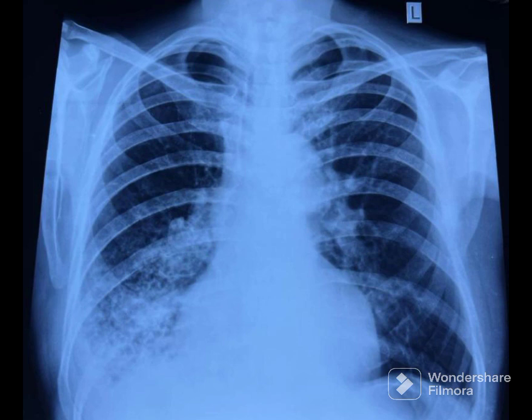Also, the right heart border is partially silhouetted. Applying the principle of the silhouette sign, the consolidation should be in the right lower lobe and right middle lobe.